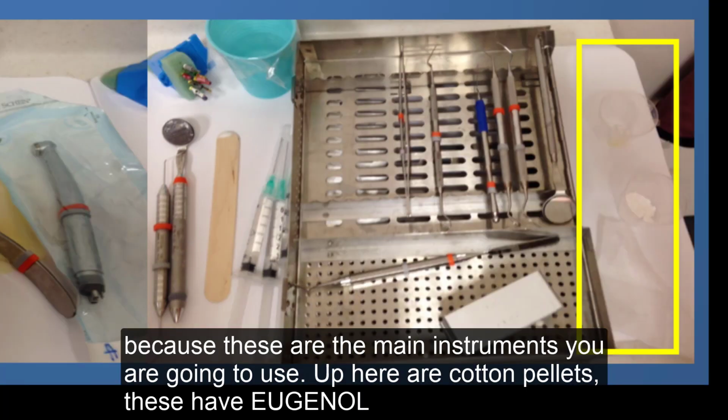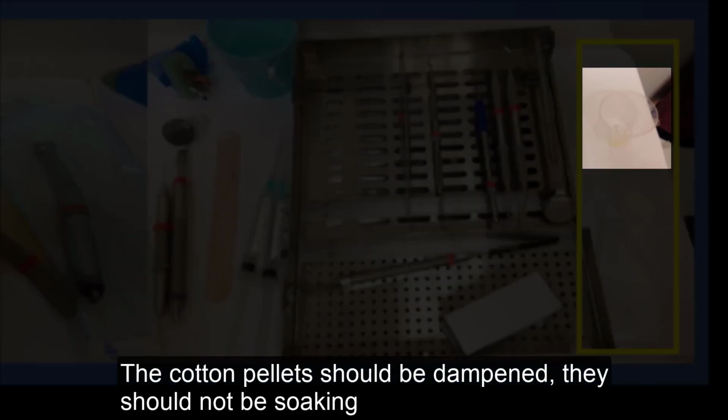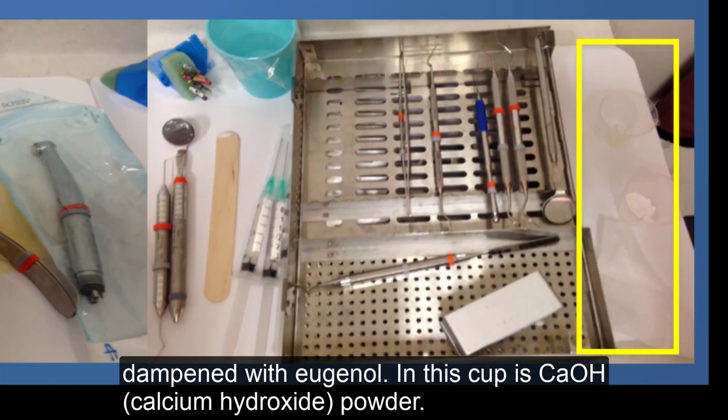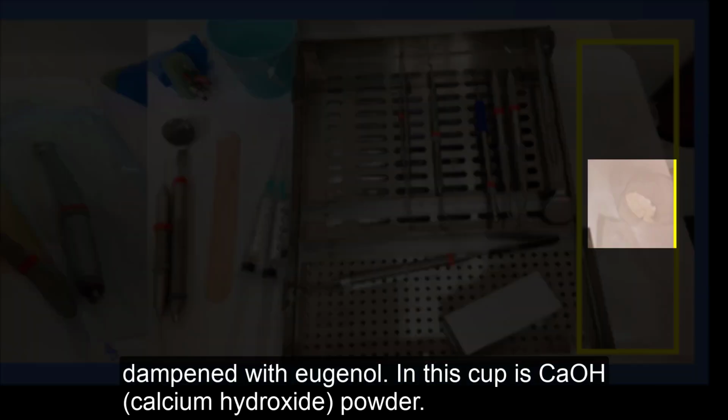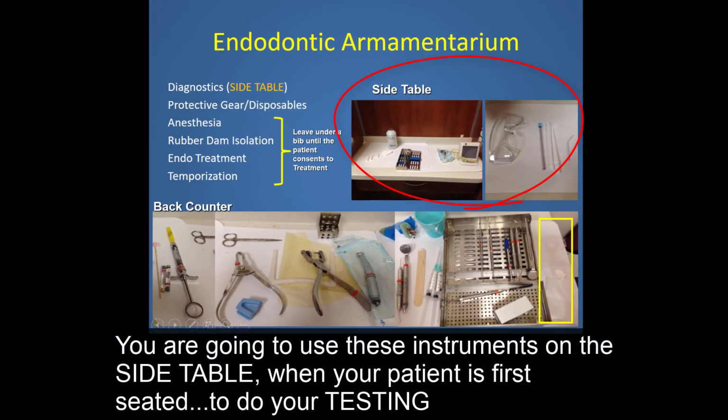Up here are cotton pellets. These cotton pellets have eugenol. The cotton pellets are just dampened. They shouldn't be soaking, but just dampened with eugenol. And in this cup is calcium hydroxide powder. You're going to use these instruments on the side table when your patient is first seated to do your testing.